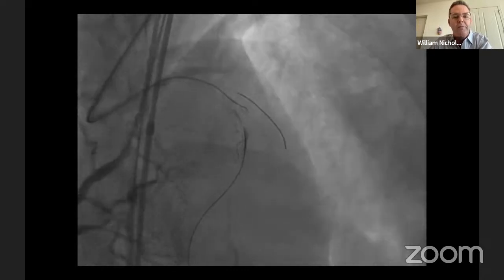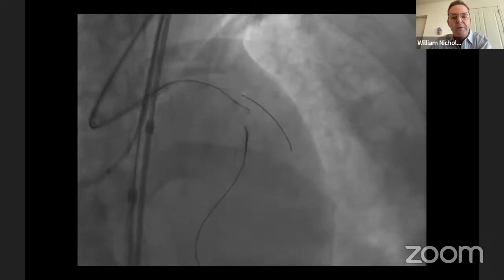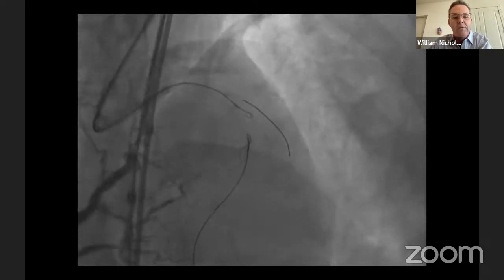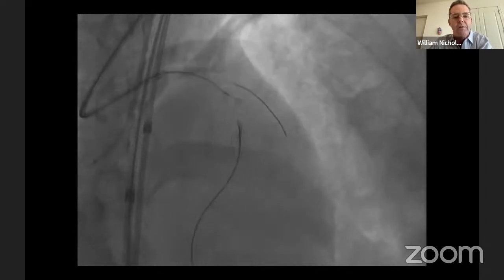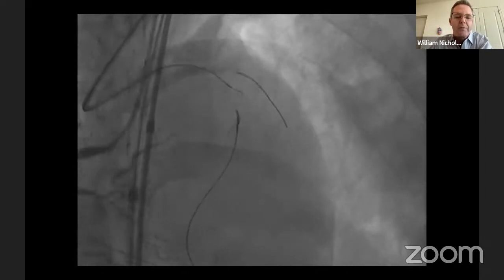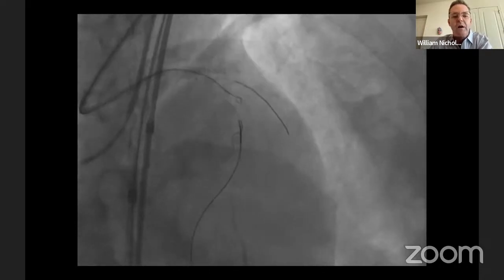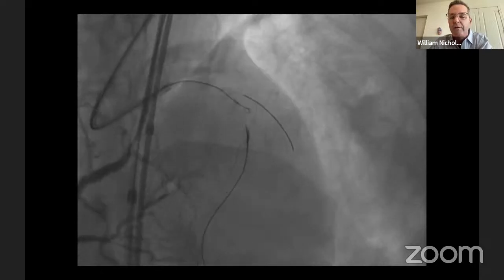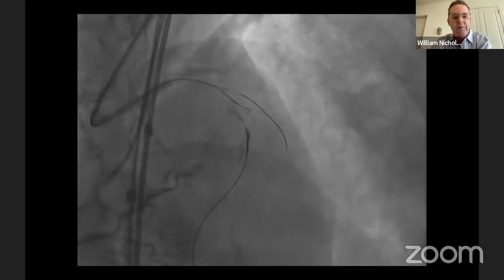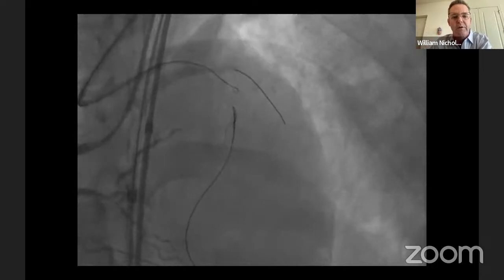We were thinking of setting up for reverse CART, thinking maybe we could come back and STAR into the diagonal, which is a technique that we use not infrequently in the States. And I think, again, it's not the most favored thing around the world, but we're part of the STAR registry trying to figure out how these patients behave long term when you come back and take a look at them at 8 or 12 weeks. What's your ability to rewire into the side branch through some of the fenestrative flaps that we invariably connect?